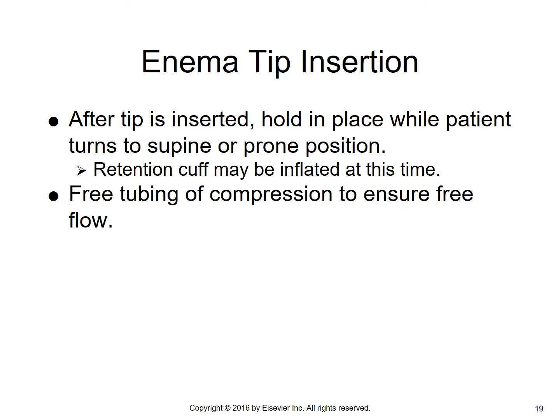Hopefully you got that enema tip in though, and after it's inserted, hold it in place while the patient then turns to the supine or the prone position. At this point in time, it says retention cuff may be inflated. Once again, most of the time, this is done under fluoroscopic control by the radiologist.